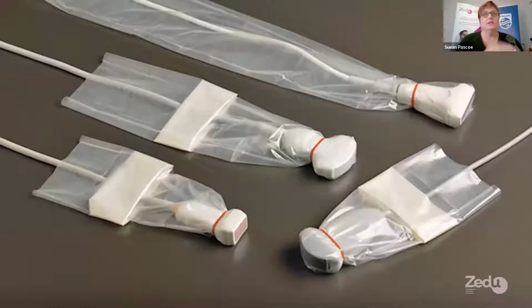There's lots of different versions of this. There are sterile freezer bags, or specifically made probe covers that are manufacturer specific. Sonosite has their version, Philips has their version, and GE has theirs, and it fits those probes exactly. The different probe covers depend on what you like and what your hospital actually gets. Some of them are much easier and more friendly to use, and some of them are a bit clunky and big and make it harder to perform the procedure. But whatever you're doing, as you prepare your probe cover, make sure it's all nice and tight. There are no air gaps along the top here, and there's not a whole heap of loose bag here that you can accidentally put your needle through.